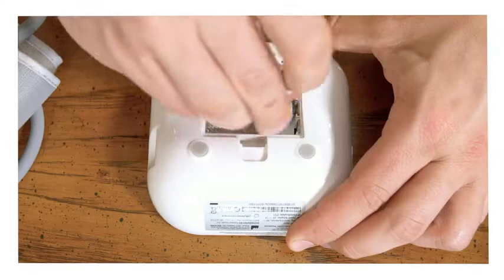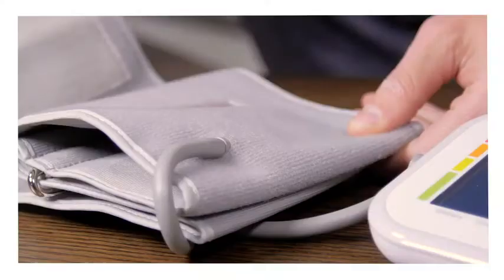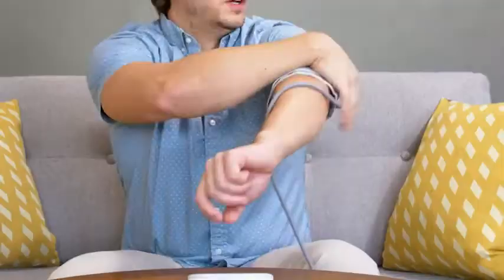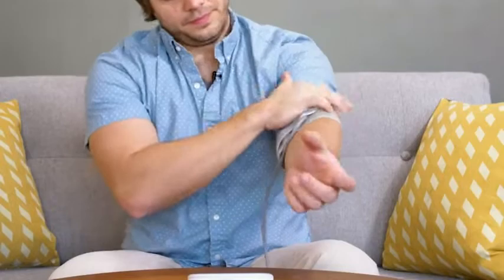I'm going to go ahead and load up the batteries. Let's go ahead and put on the cuff — there's a little line here that's going to show you where to align this with your artery. You can cinch it up and then rotate it back to where it needs to be, right there.